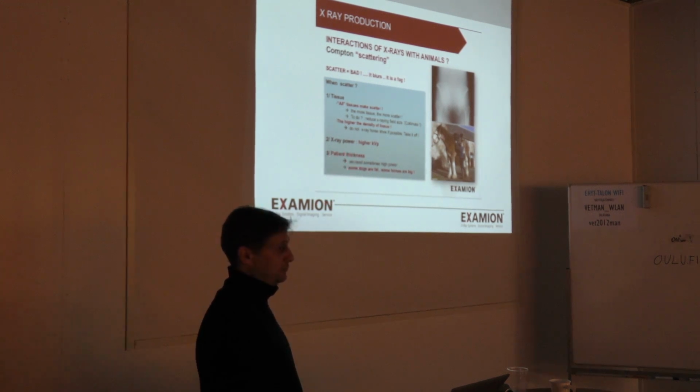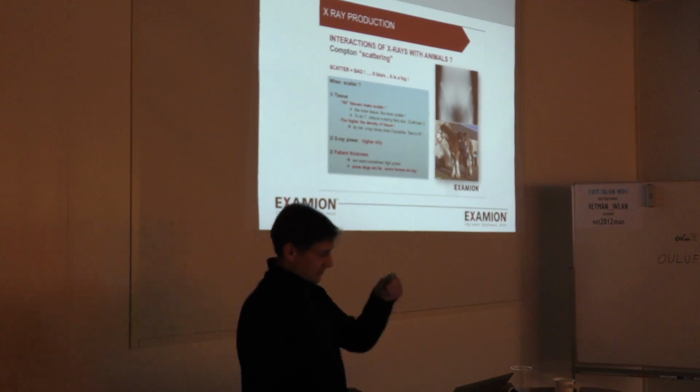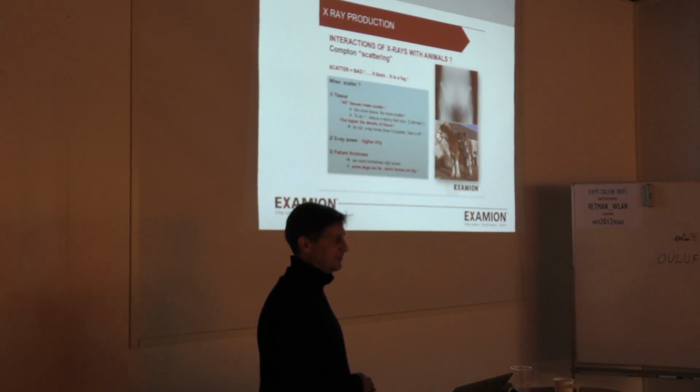And the patient thickness overall. So you see, it's just one of the factors. You measure the thickness, and then you calculate the kilovolt and mAs. Okay?